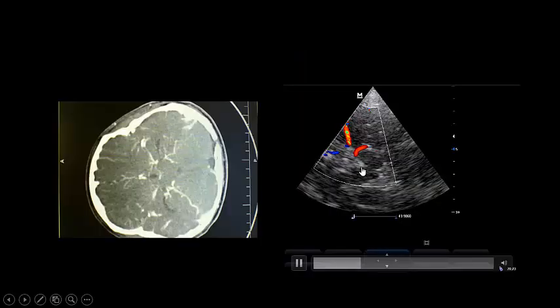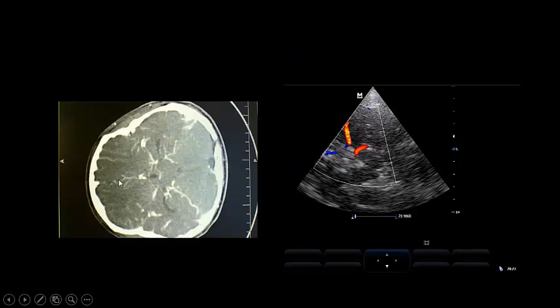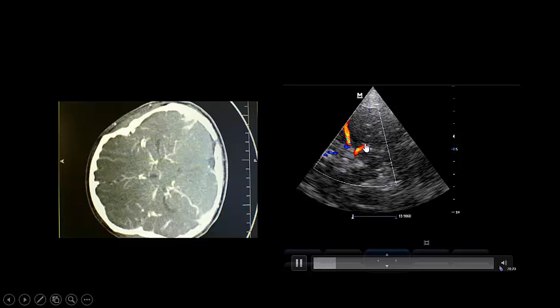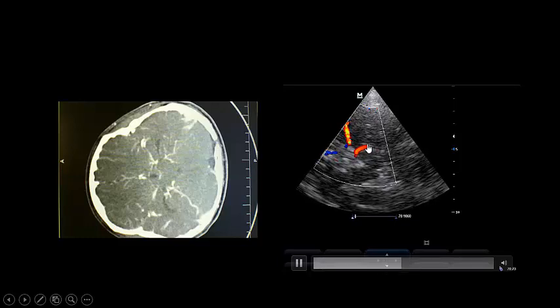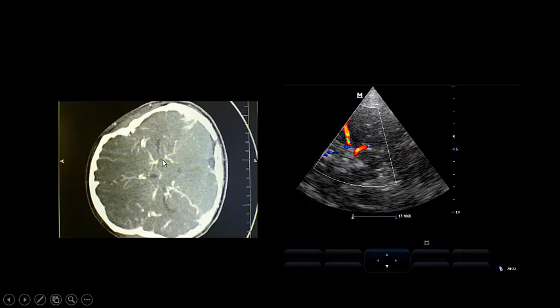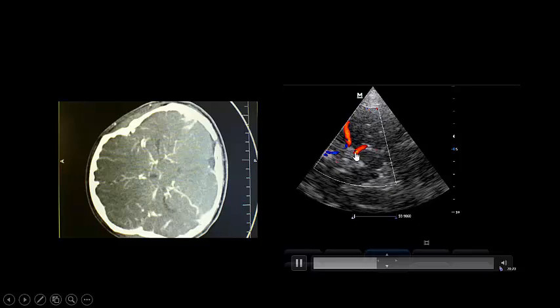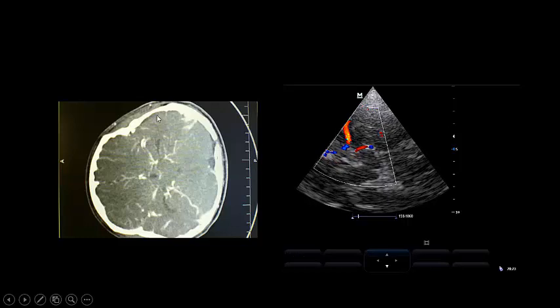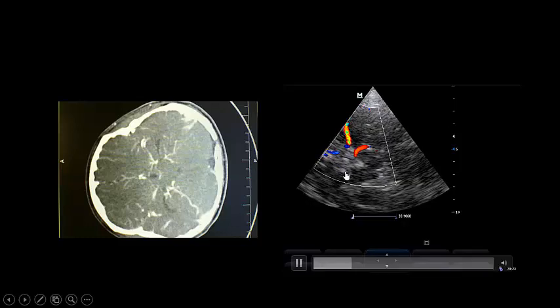Here in a patient with CT angiography compared to transcranial color-coded duplex, you can see the butterfly appearance and the posterior cerebral artery curving around the midbrain. You can also see the middle cerebral artery on the left side — a beautiful correlation between CT angio and TCD imaging.